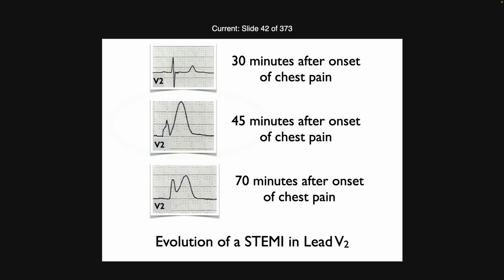Okay, so in pre-hospital settings, is there an actual time or a definition, a set time, of how many 12 leads we're taking, or are we just monitoring and waiting for changes? Here's how I feel about it. This is just my opinion.